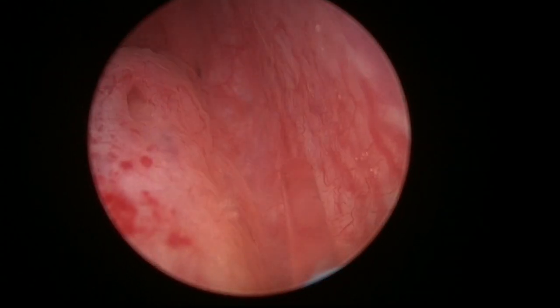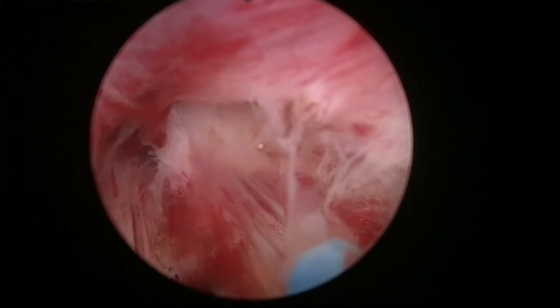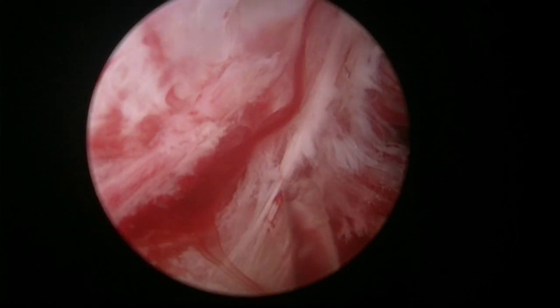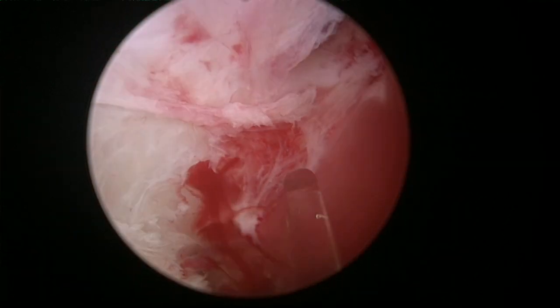So sometimes you can even have trouble, let's say, finishing the marking of the white line. If there's a lot of blood, like now, where you come to a point where you don't see very well, my advice is to go in the plane, to look for the plane and start enucleating. If, on the contrary, you can see very well, my advice is to develop a groove following the white line. If you deepen the white line a little bit, you can develop a groove that establishes a separation between the adenoma and the apex, no?